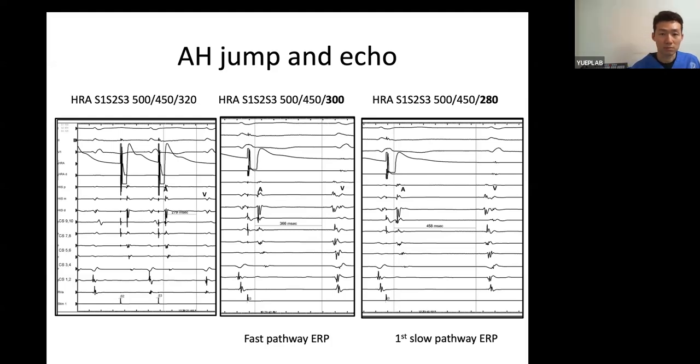Okay. If you have a proximal CS where the funnel shape is, and you ablate the roof of that, you will have a heart block. Now, some patients have a shallow or narrow range of the CS. If you try to ablate the roof of that CS, it will be problematic. So we don't ablate the roof of the CS. We are looking for the slow pathway potential before we ablate. When you get to the anatomic site, you should be able to see the slow pathway potential there, then you ablate. Not just the anatomical roof. We don't do an anatomical approach. Even though we are talking about anatomical location, all AVNRT should be done under slow pathway potential guidance.